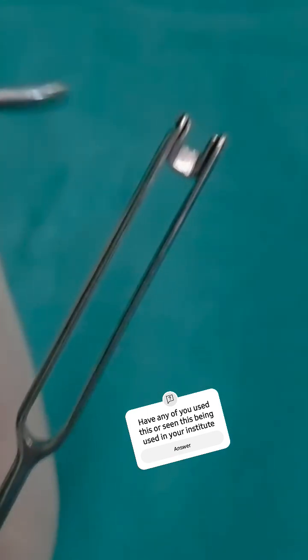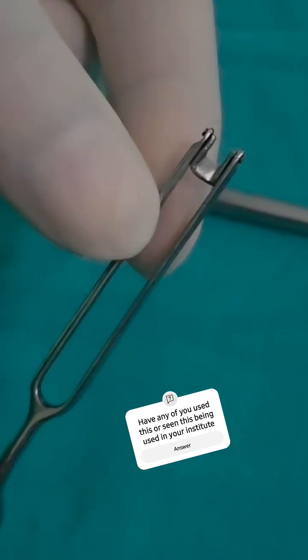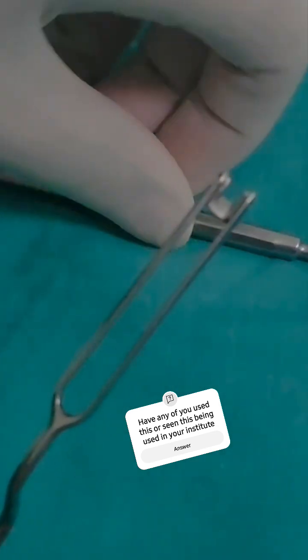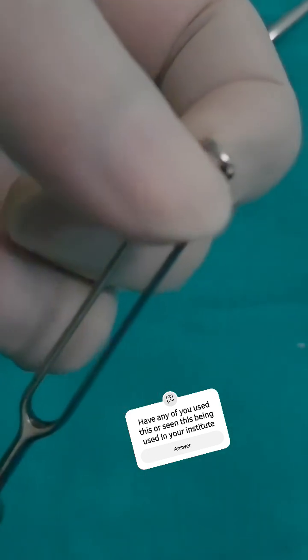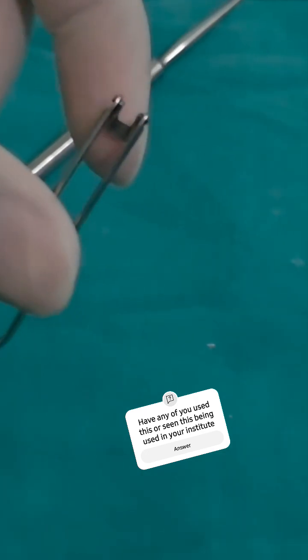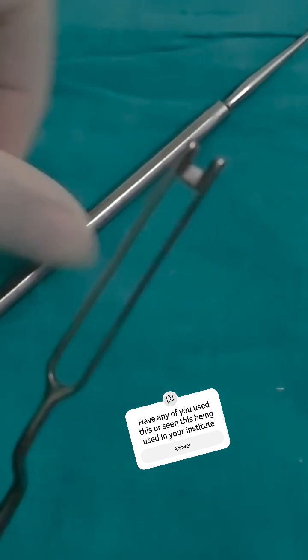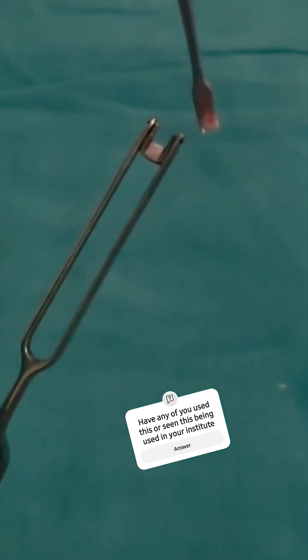Interestingly, this blade is called a swivel because it can rotate 360 degrees — it is a rotatable blade. This edge is the blade, and there are two guards which will protect.